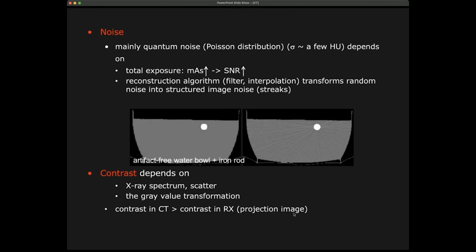So next, there's the noise in the images, and the noise is very much related to the amount of photons we have. These photons are made by a non-ideal source, which is in some way stochastic, and then the interaction, the absorption, is of course also a stochastic thing. Does the X-ray come to an electron, yes or no? So that means there's some intrinsic noise. And then there is also the noise from the reconstruction again, where we need to do some interpolation or something like that.